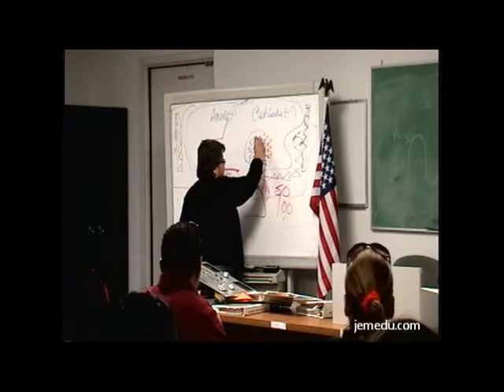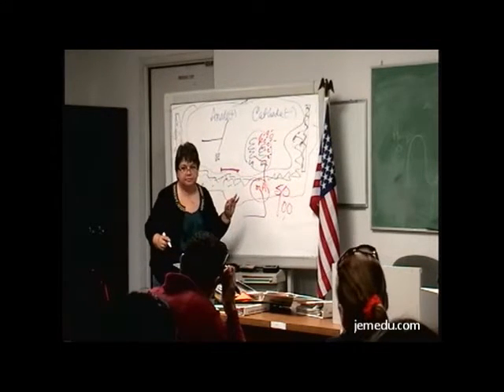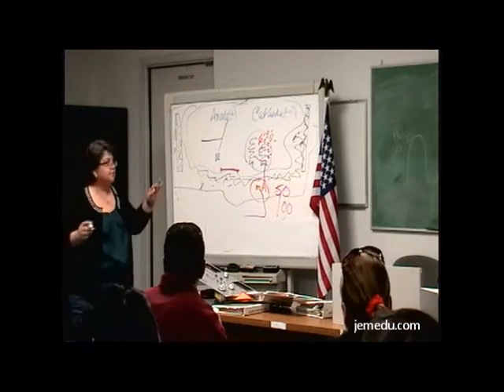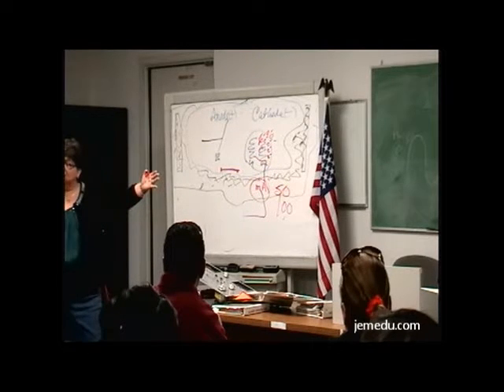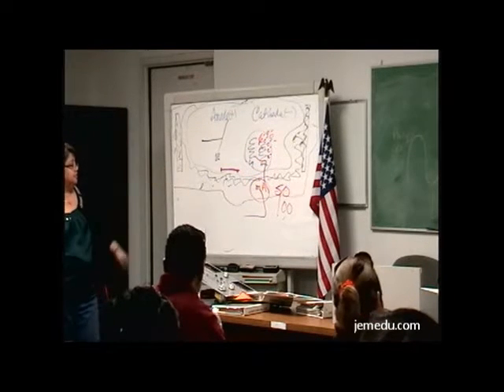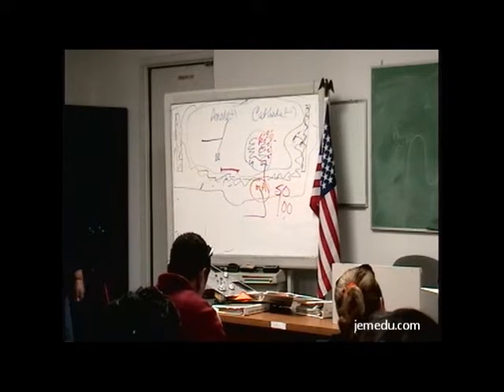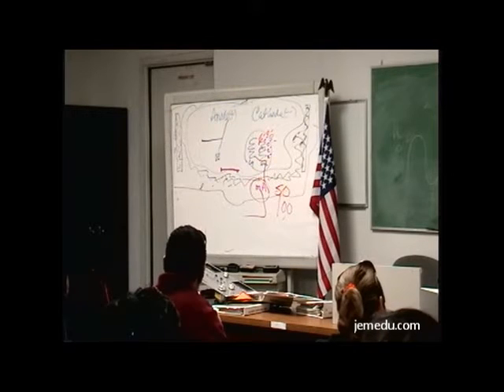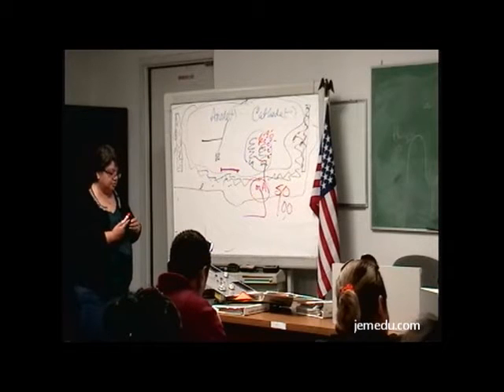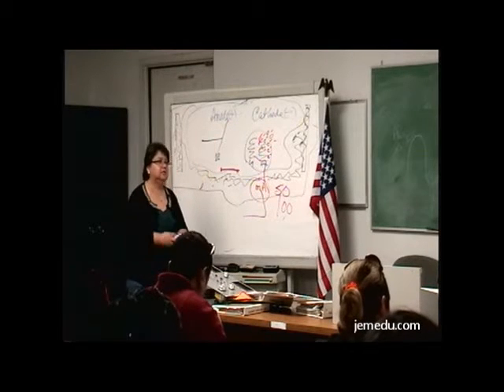So now what's happening to this side of the X-ray tube? What's happening before that even happens? What's happening to the tube as a whole? They're going to ask you this. As you start adding more electrons to that side of the tube, what is happening to the tube? On that side of the tube, I have more charge. What kind of charge? Negative. Is that balanced? So right now, what do those electrons want to do? Go over to the anode side. What's likely going to move, the electrons or the anode itself?